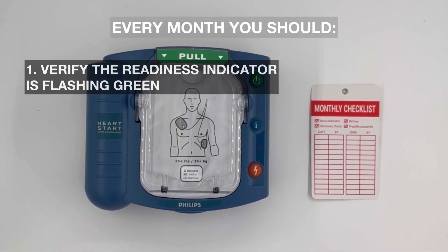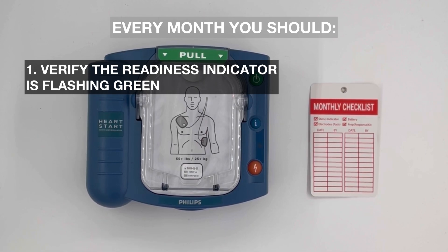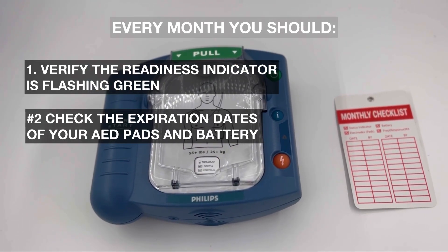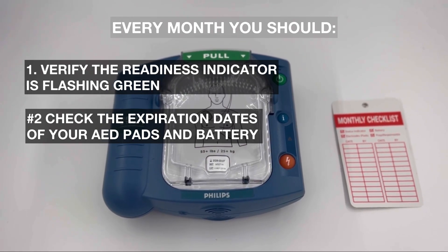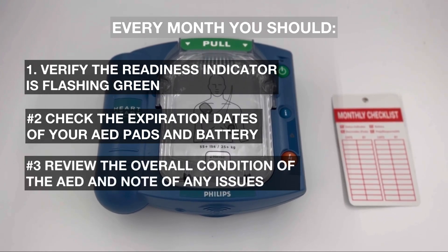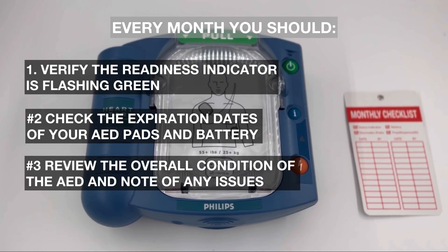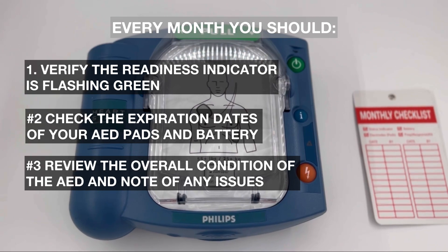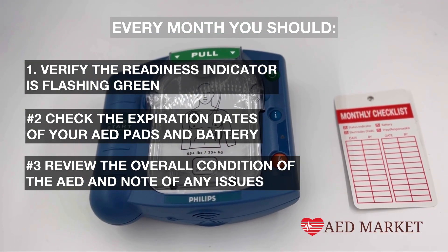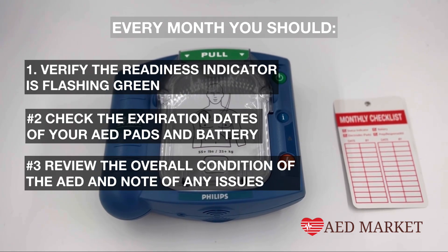Every month, you should: 1. Verify the ready light indicator flashes green. 2. Check the expiration dates of the AED pads and batteries — the pads have a 2-year expiration and the battery has a 4-year expiration. 3. Inspect the overall condition of the AED and note any deficiencies. You can log each monthly inspection on the AED check tag we provide for free with every AED.